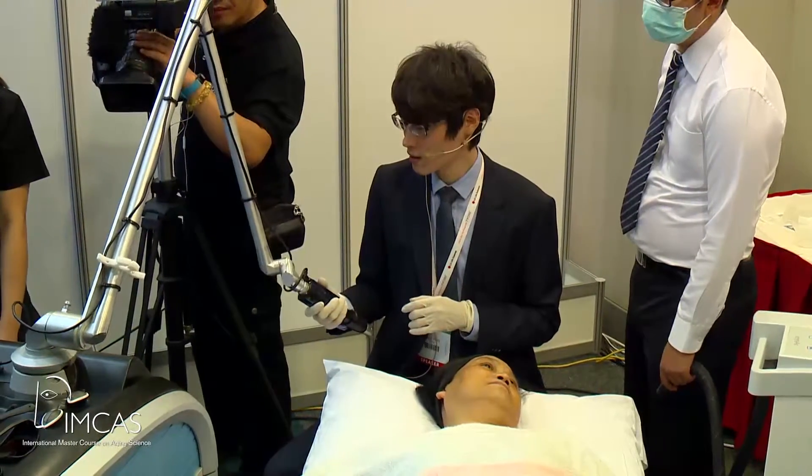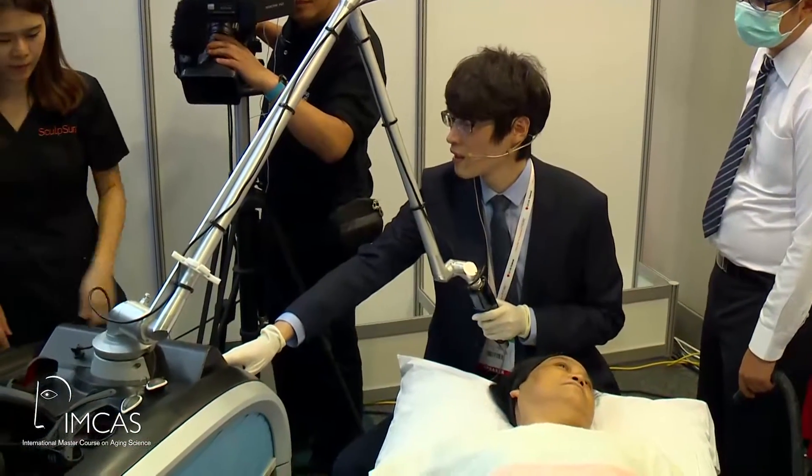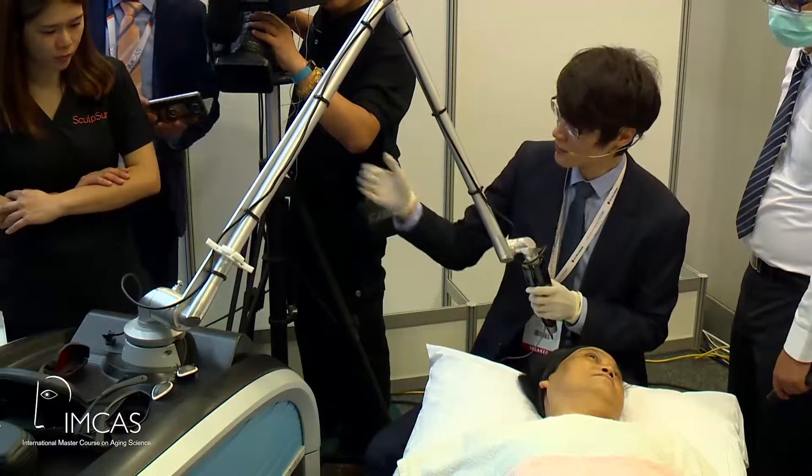I am using the zoomed handpiece. And as you can see, I'm using a little bit higher energy than Dr. Lin. What he did was around 0.7J, and now this is around 1 joule. So let's go back to our patient's face.